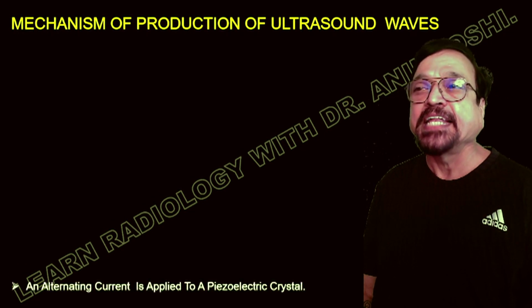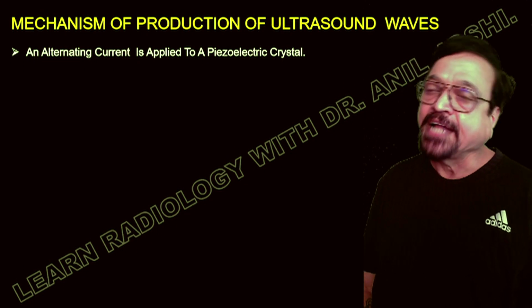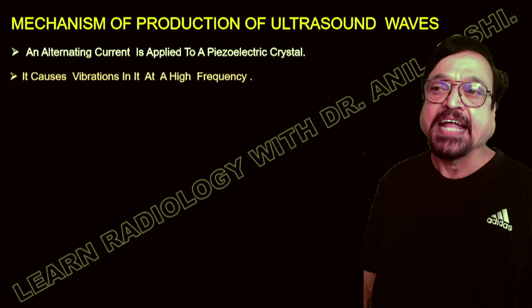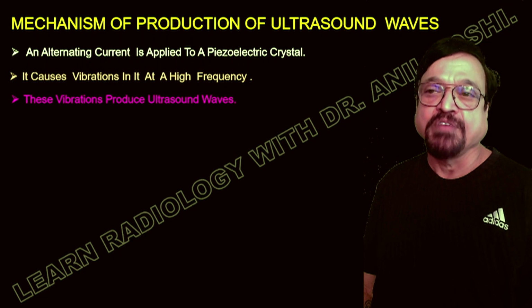Now what is the mechanism of production of ultrasound waves? An alternating current is applied to the piezoelectric crystal. Now this causes it to vibrate at a high frequency. These vibrations produce ultrasound waves.